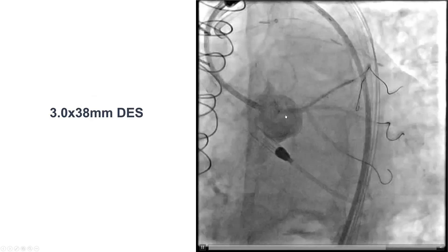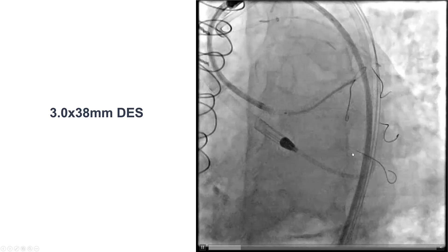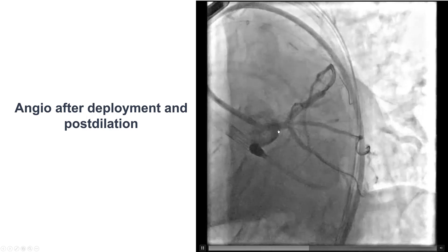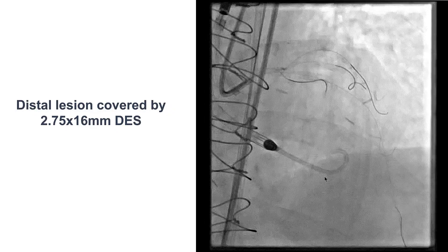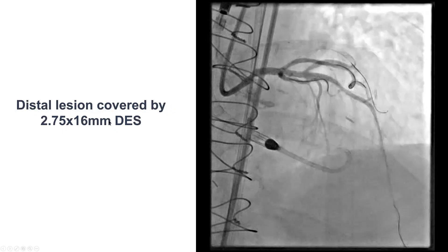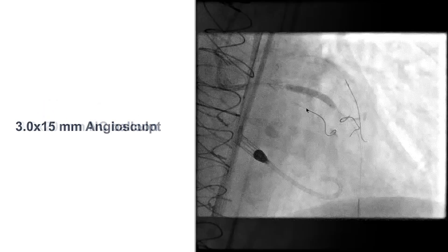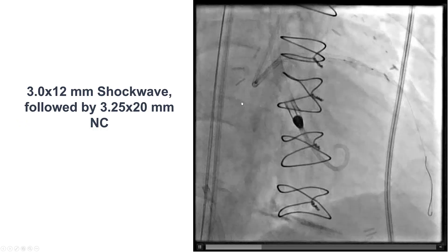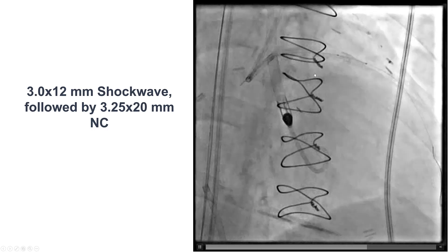We stented all the way from the left main ostium into the middle LAD. We did have wires for protection in both the circumflex as well as the Ramus branch, but fortunately there was no compromise in flow in either of those two branches. There was some residual disease, which is why we placed an additional drug-eluting stent that was post-dilated with a 2.75 mm balloon and an AngioSculpt, but by intravascular ultrasound there was poor expansion again because of heavy calcification.